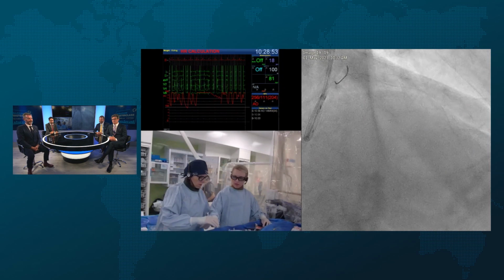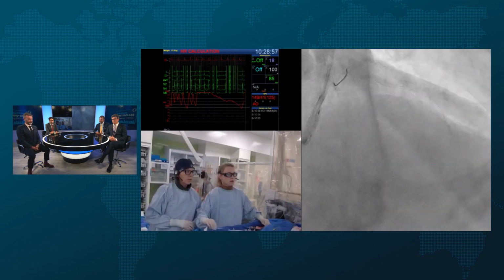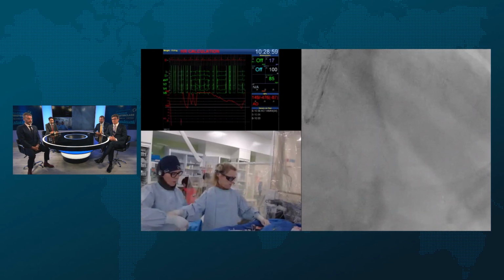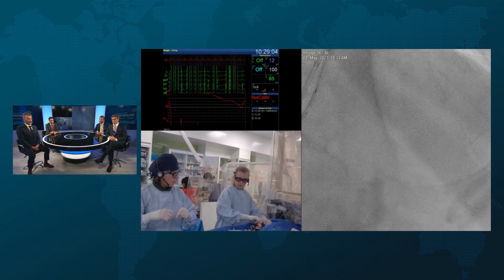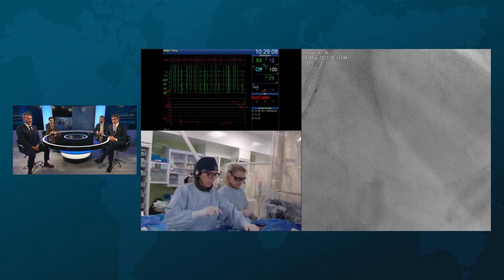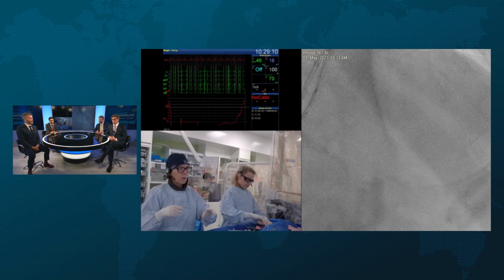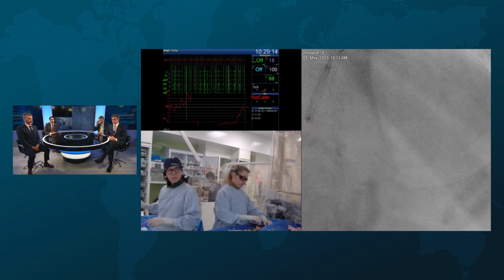It's really important that you actually took the microcatheter down, not just from a wire switch-out standpoint to get your workhorse, but also to give you a lot of information about the lesion. If you take that microcatheter down and it just sort of zips down, that gives you a lot of information as opposed to really having to work it down. That's going to give you more of a sense of whether you need to do some atherectomy up front, but it looked like it zipped down okay.